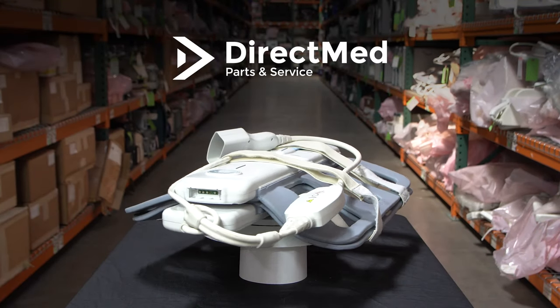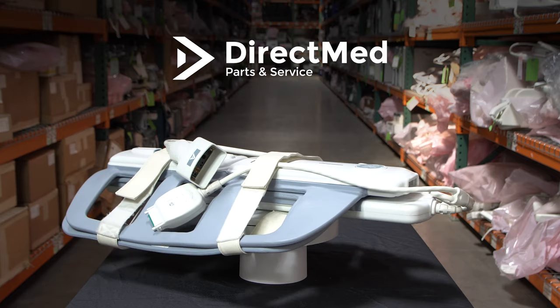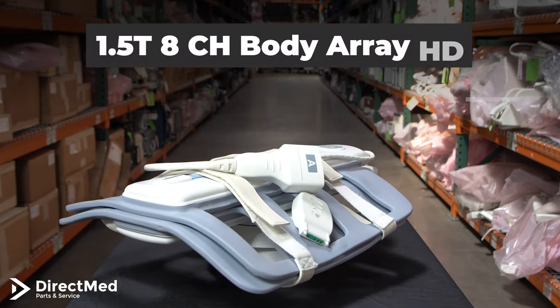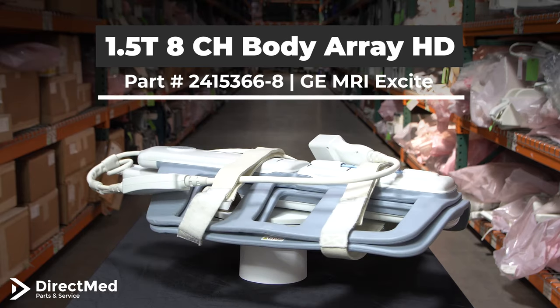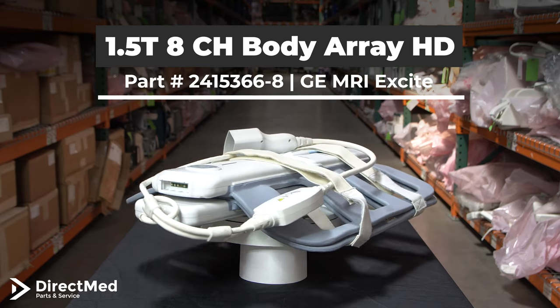Hello everyone, this is Eric with Direkman Parts & Service, the largest global supplier of quality replacement imaging parts and repair services. Today we're going to be talking about the 1.5T 8-channel body array coil with the HD connector, part number 2415366-8. It's compatible with the GE MRIX site.